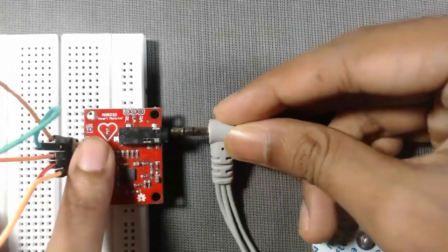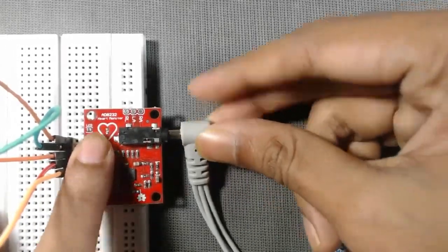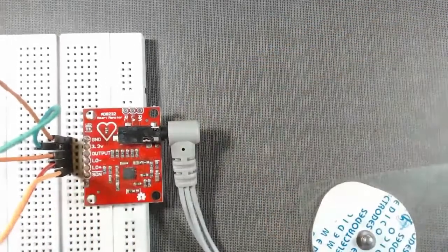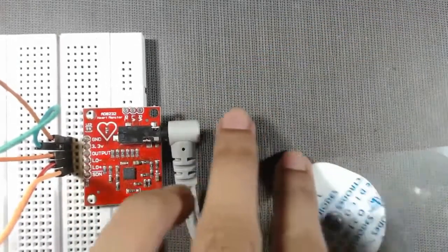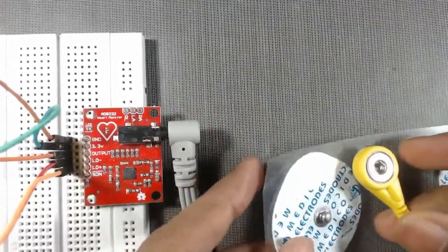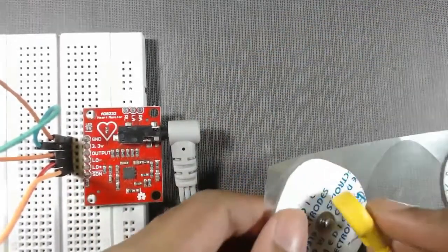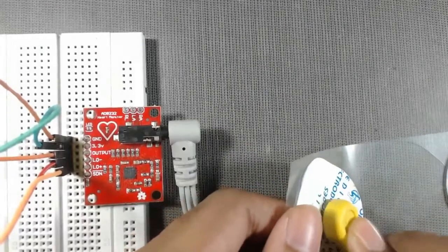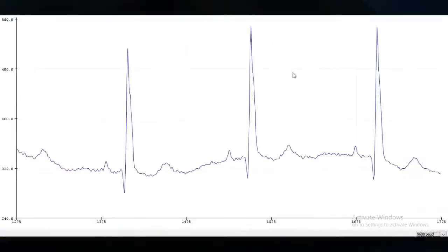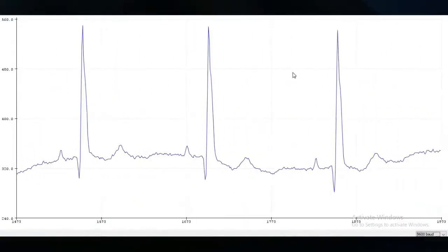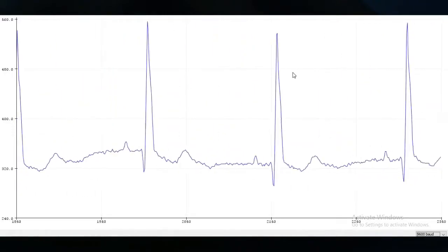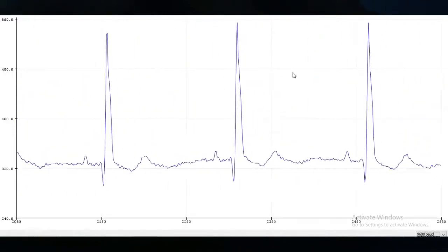Hello friends, in this video we will learn how to interface an AD8232 hardware ECG sensor with Arduino Uno or Arduino Mega, and we will observe the graph in Arduino serial plotter.